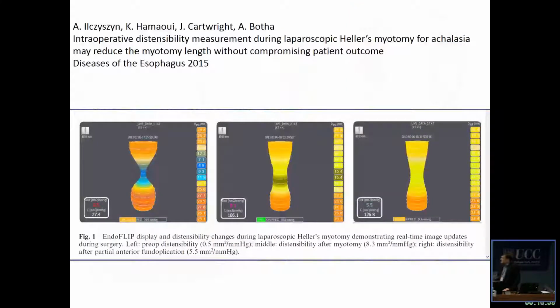And it soon found quite a lot of applications. As I mentioned before, I think it was commercialized in 2009 or 2010, been adopted by several groups. This is an example from an achalasia patient, where we see a very tight sphincter here. So the balloon primarily fills up in the esophagus, down in the stomach.